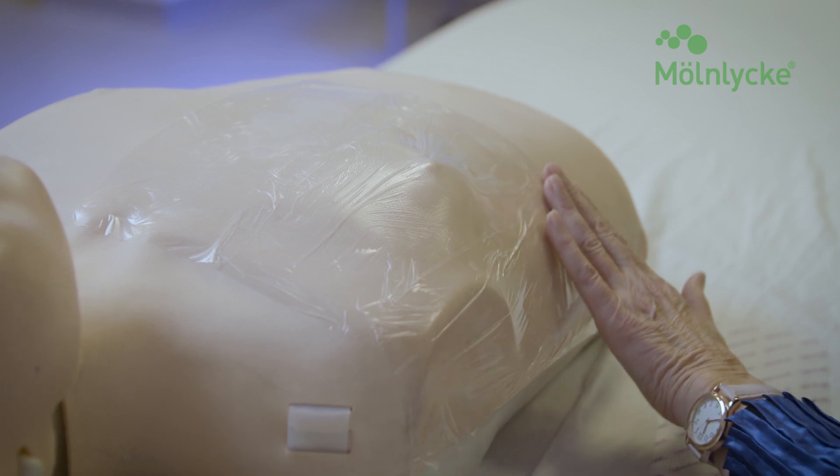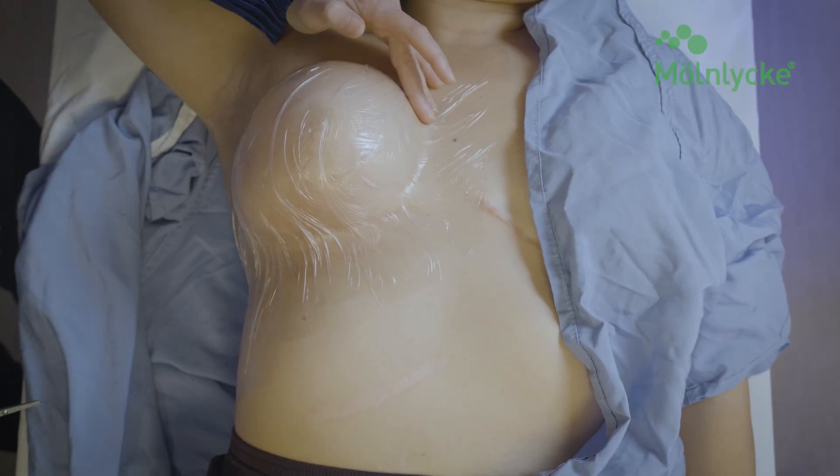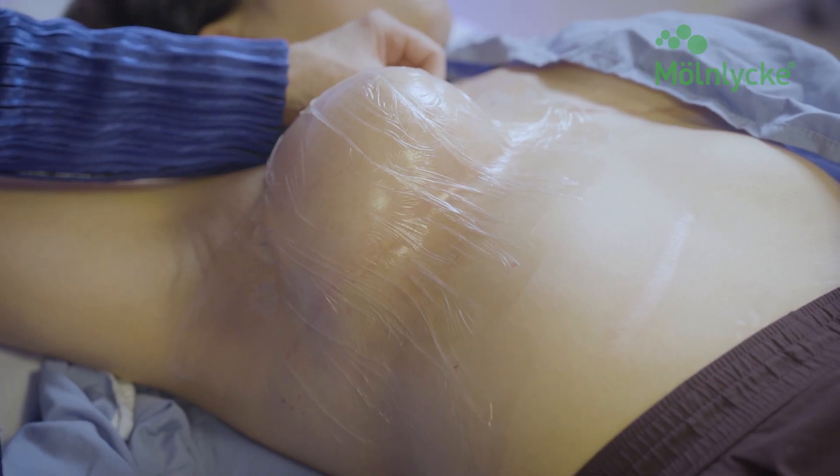Reassess all areas where the film has been applied and gently press away any air bubbles. The patient will wear and maintain the dressing throughout the radiation treatment.